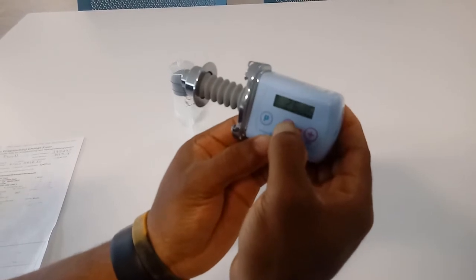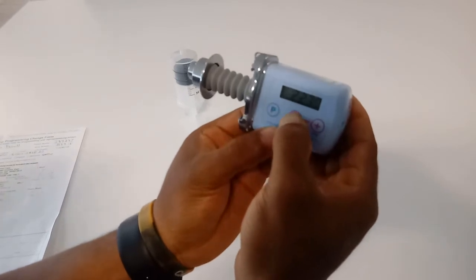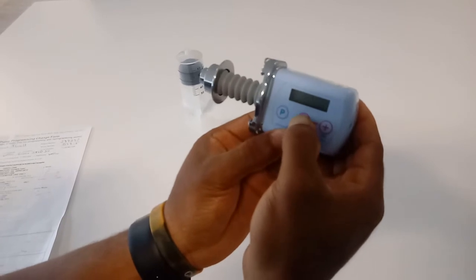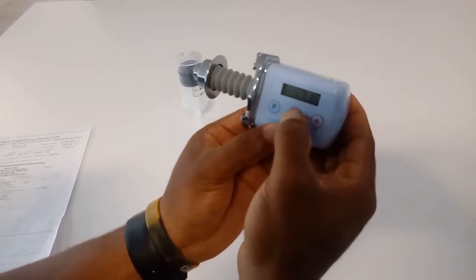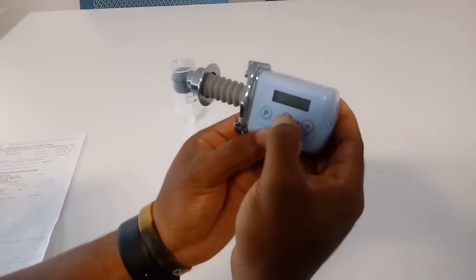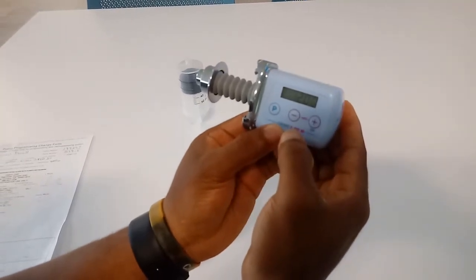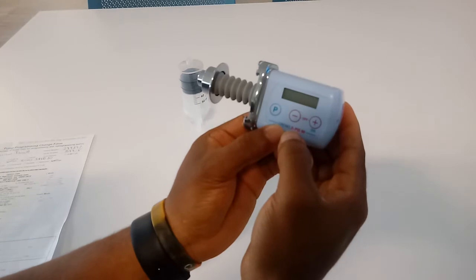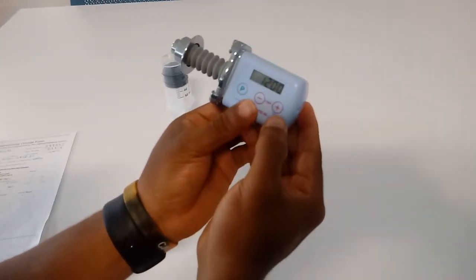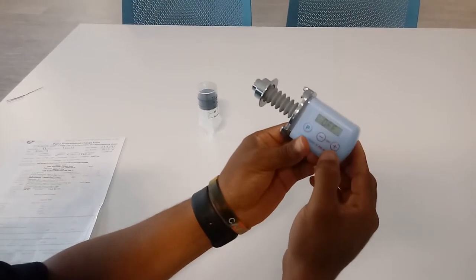so we are getting close to the halfway mark. All right. Getting there. All right. Now this is it right here. Now you stop. It's going to set. It's going to stop blinking. Now we know the pump is programmed. So we're going to turn the pump off by pressing both the negative. Hold on. So this pump we have programmed for 12 hours.